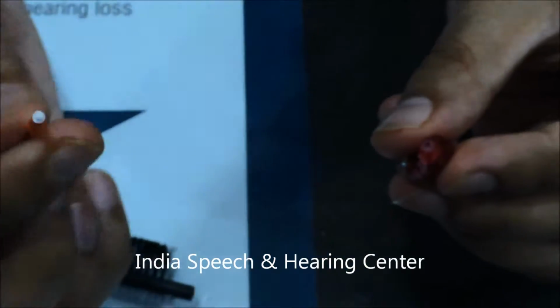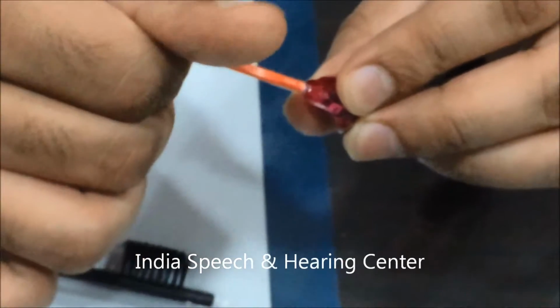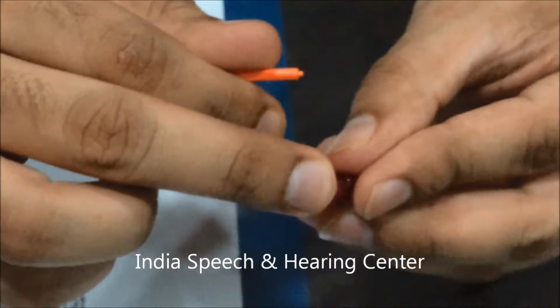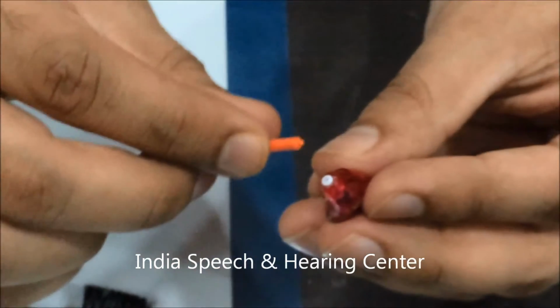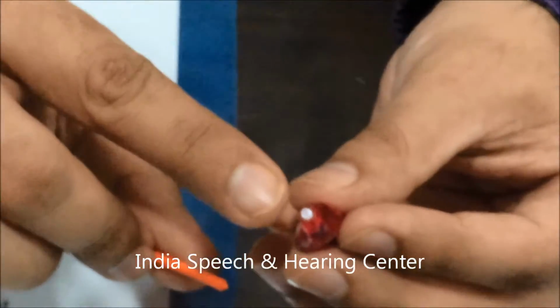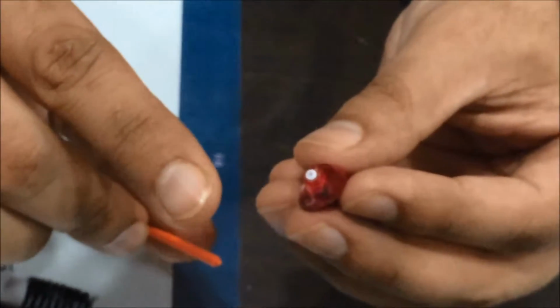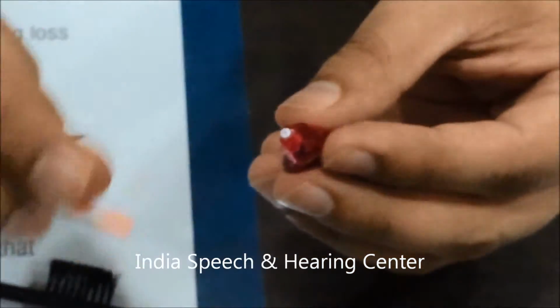You can just wipe out the outer end of this. Then you change the side and insert the new wax guard inside the hearing aid. Sometimes you may require to adjust it slightly. This is how you will replace the wax guard. Whenever the wax guard is blocked, the easy way to identify this is if it is brown or blackish in color, or the output of the hearing aid is reduced whereas the battery is still working, it is time to change the wax guard.